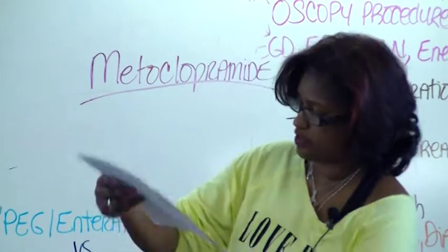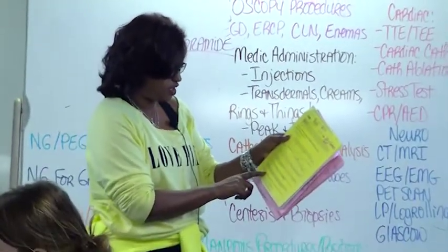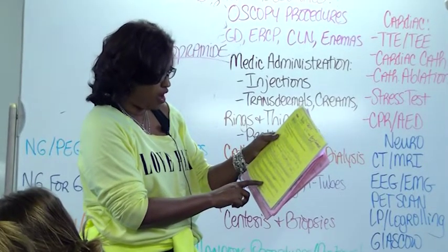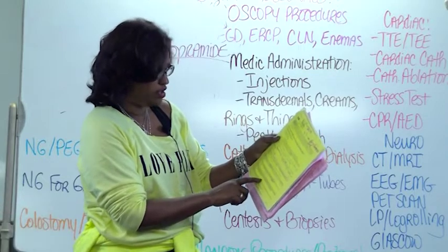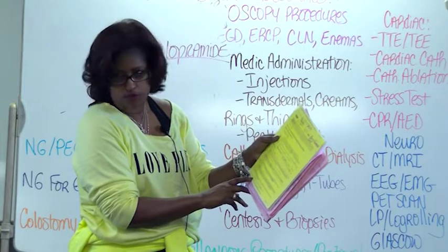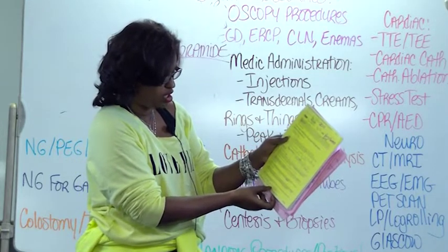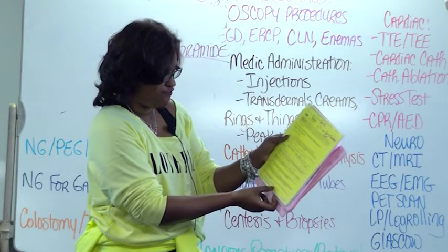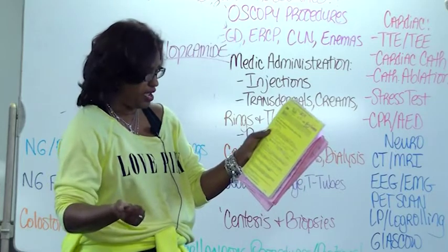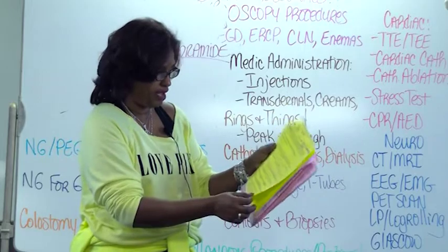Now, there's one more little thing here. It says, give the medicine, use a syringe, drop the medication, highlight it. Give them one after another. Now, here's what I tell you to do. I wrote it in big letters at the bottom. I do a crush, push, flush routine. Crush the med, push the med, flush after every med.